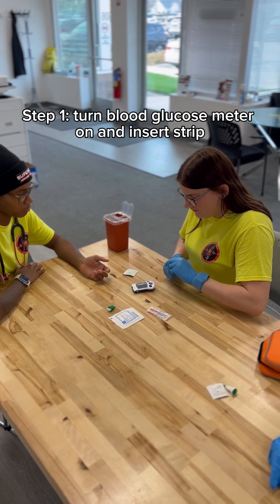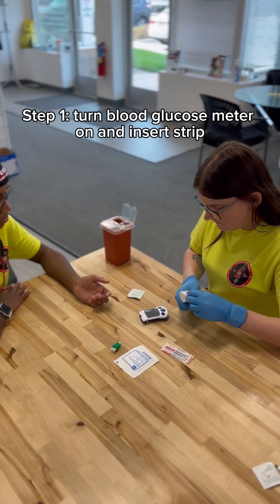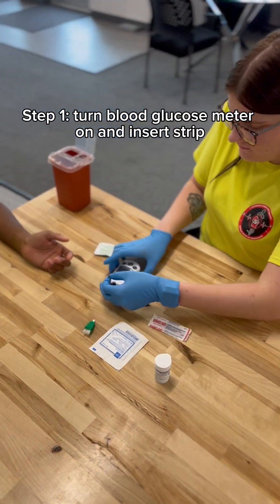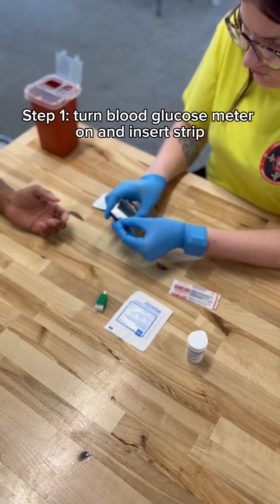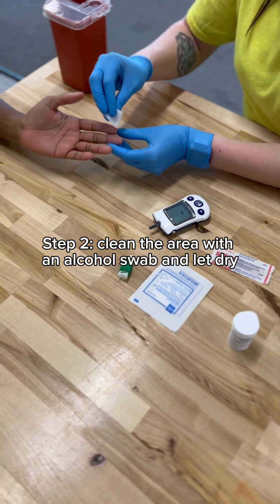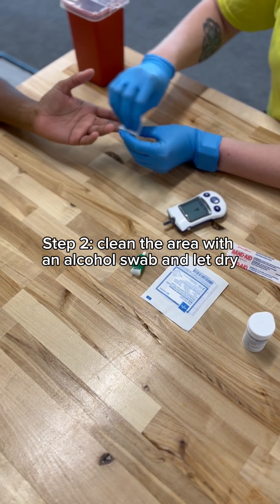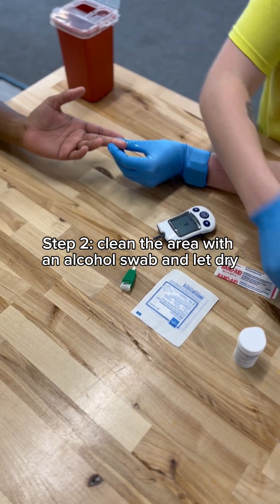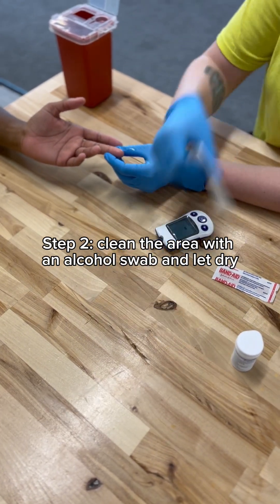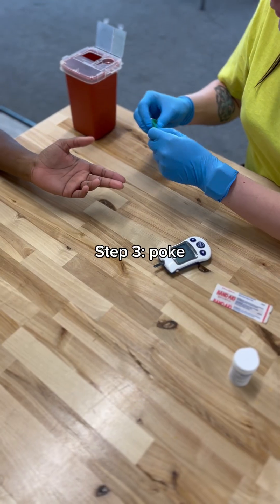First, I am going to turn the machine on and grab a strip out of the container. We're going to put the strip in. And then we are going to clean the area with an alcohol swab, and we are going to let it dry for a little bit.